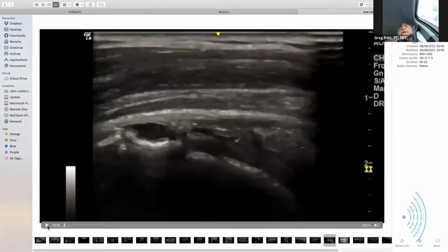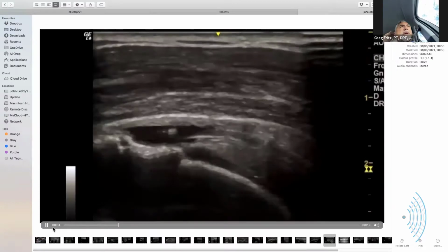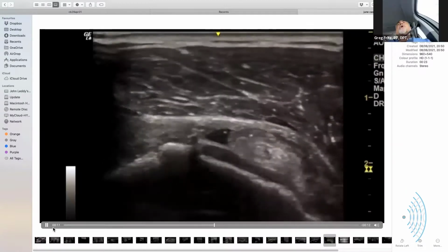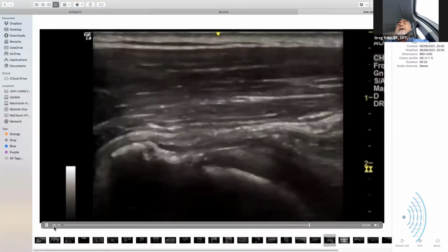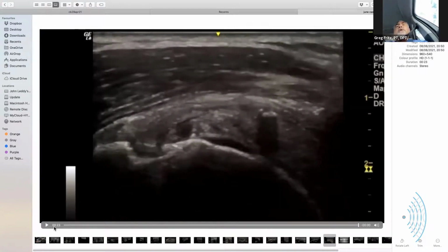So, John, as you take a look at the classic subacromial view of that, to what extent do you then go to a posterior view and internal rotation assessment of the enthesis of the infraspinatus? If you can clear it with one, do you always do the other to verify infraspinatus? No, I scan infraspinatus in the same position as I scan supraspinatus.